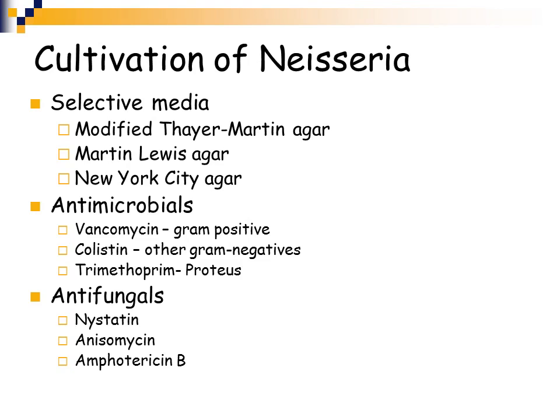Now, there are selective media that are very commonly used to isolate Neisseria gonorrhea, and these selective media include modified Thayer-Martin agar, Martin-Lewis agar, and New York City agar.